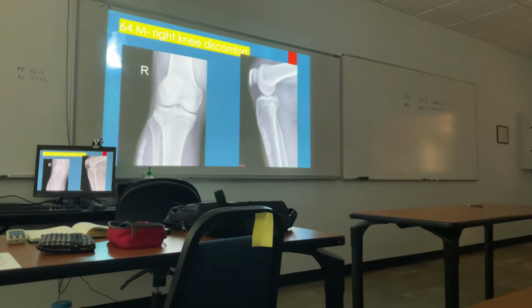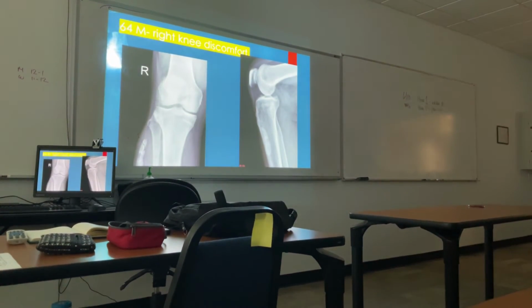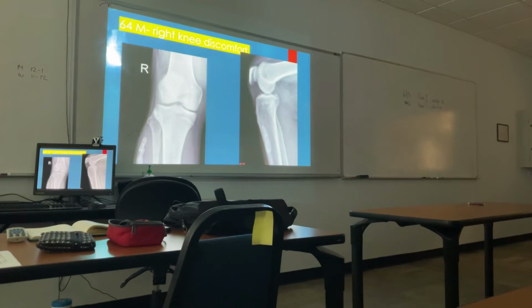Is that soft tissue? Is that radiolucency on the tibia, or just the patella? Direct me. On the tibia, on the lateral, just the medial aspect? Right? Yeah, right there, that radiolucency right there?